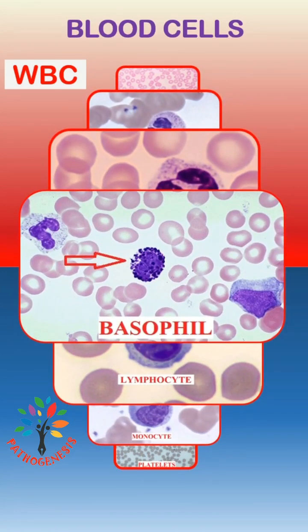Basophil has intense granulation in their cytoplasm. Granules are basophilic, that means blue in color. The granules often cover the nucleus.